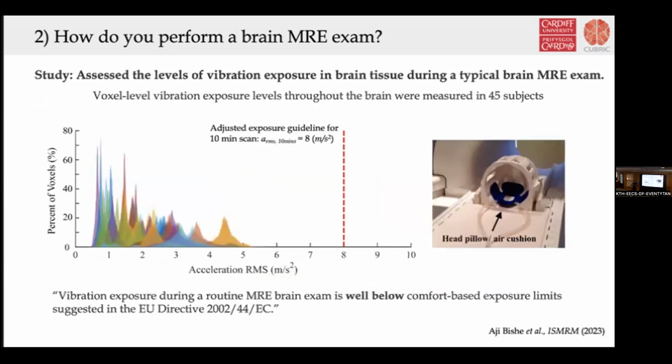A question you always get asked is, well, how safe is this? It happens time and time again. So I'm really glad that this work has been presented this week at ISMRM. Very early studies obviously checked the safety, and it was well below any kind of vibration limits. But given the expanded interest in brain imaging applications with MRE, this study conducted a more comprehensive assessment of vibration exposure with the brain MRE driver, the pillow.